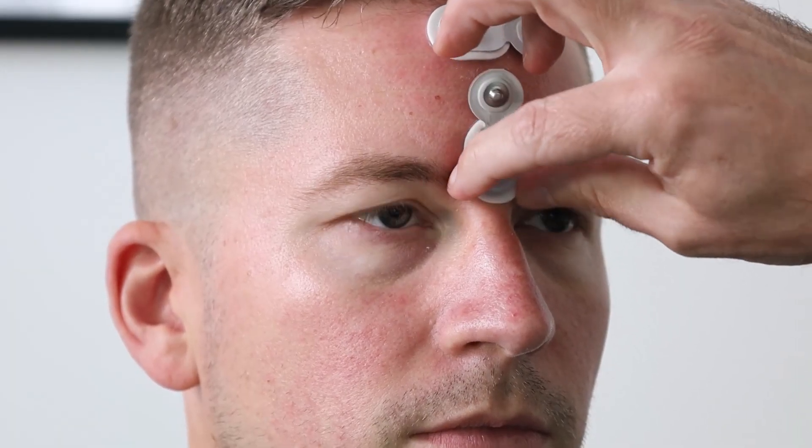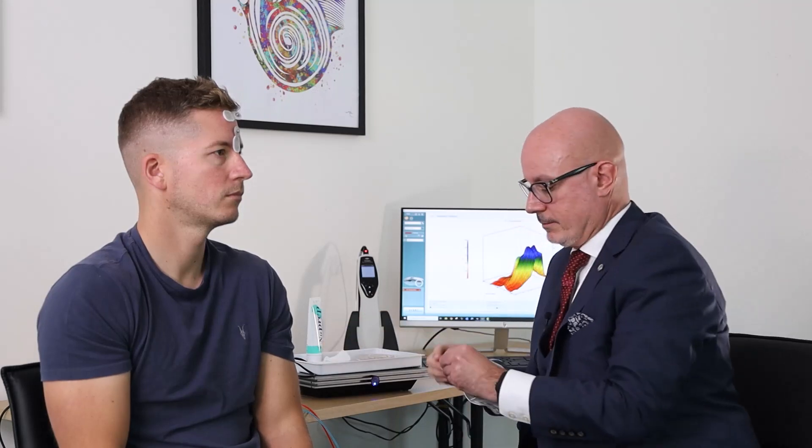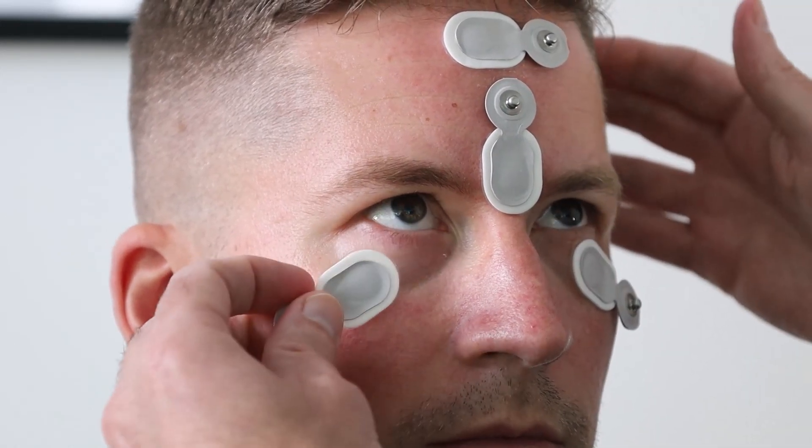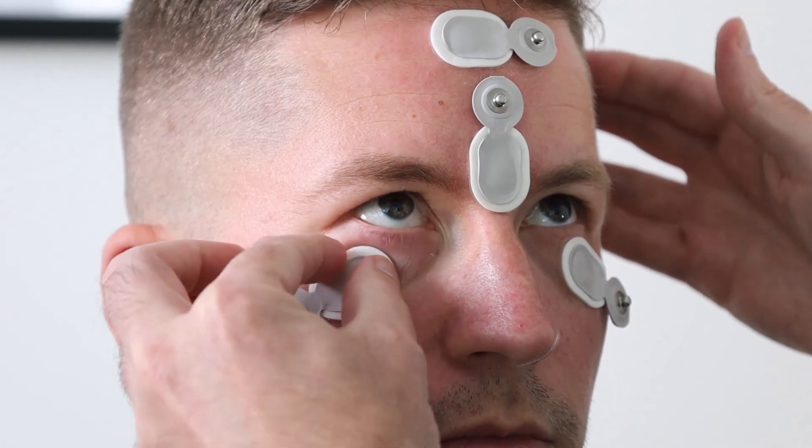Now we're ready to put our electrodes into position. We're using surface electrodes — we'll place our ground in position, just squeezing around the outside so we don't remove any of the conductive gel. Place one on the bridge of the nose, trying to keep this nice and central. We'll use this as the reference for both the right and the left side. And then underneath the eye — because we can't see the inferior oblique muscle, we look at the central part of the eye and the montage suggests we just place sweeping out to the side. There's delicate skin under the eye, so we do have to be careful as we place them, being mindful of eyelashes as well. With the patient looking up to help us, we can place and just gently make sure it's secure on the surface of the skin.